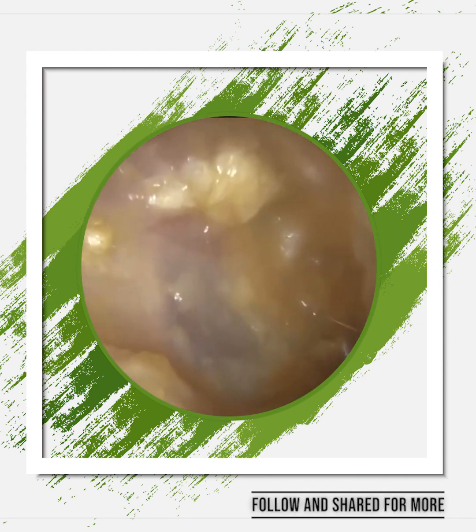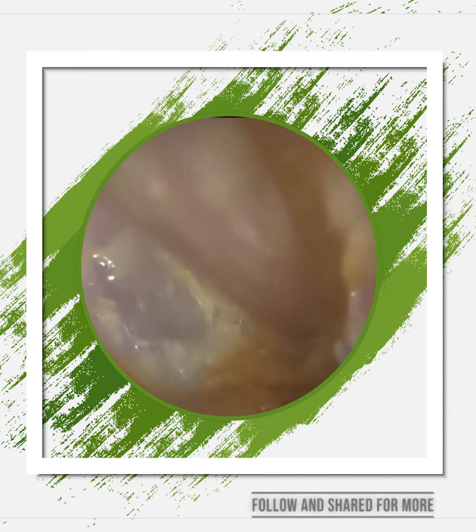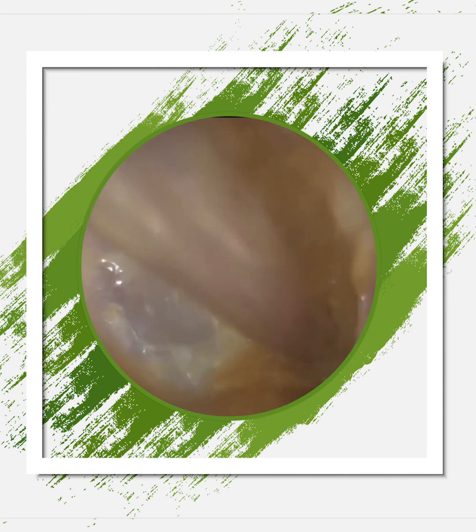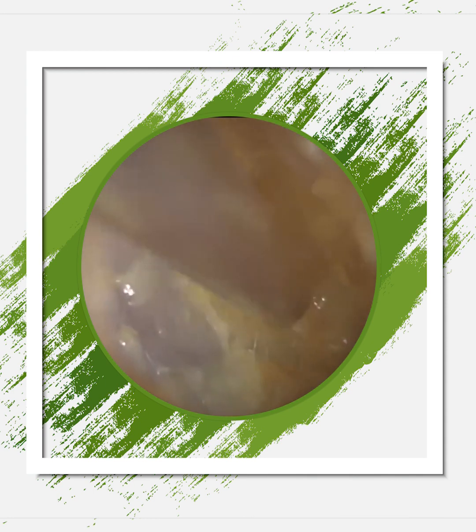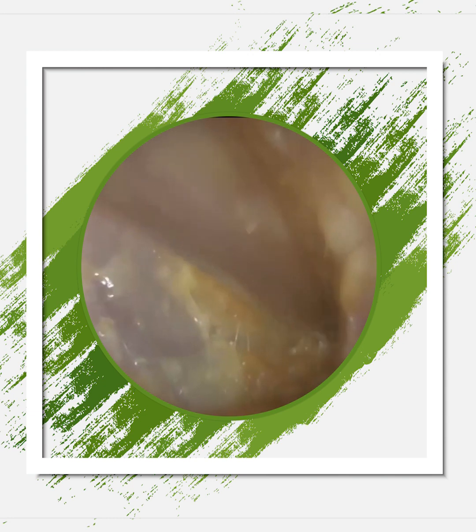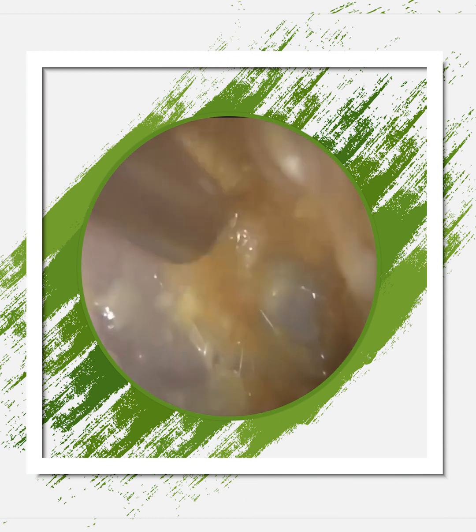So that's the technique. If any delegates are watching and just need a reminder, that is probably the most difficult thing with an endoscope, because there is no speculum. We're having to stretch the ear and keep it open with the endoscope, and it just takes a bit of practice. And once you've mastered it, it's a really great skill to use in your clinic.